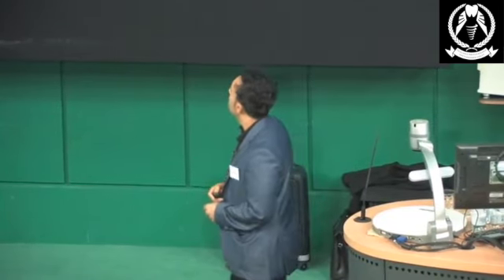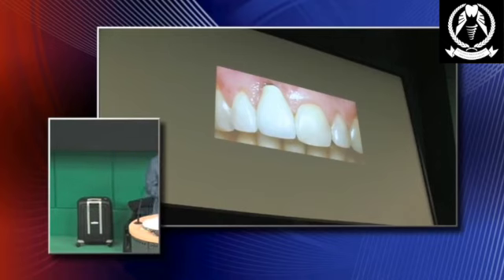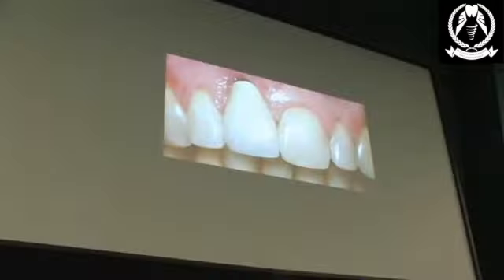So what does that mean? Why would that be relevant to you as general practitioners? Well, if that patient is offered the option of replacing that tooth with a dental implant, you may end up with someone putting an implant in and it looking a little bit like this. So you've lost literally that 3 millimeters, and if that patient has a visible gum line, that's going to be quite a significant aesthetic failure for your patient. And for an implantologist to correct this situation or avoid it, it means bone grafting, maybe soft tissue grafting, and a lot of work and a lot of time.